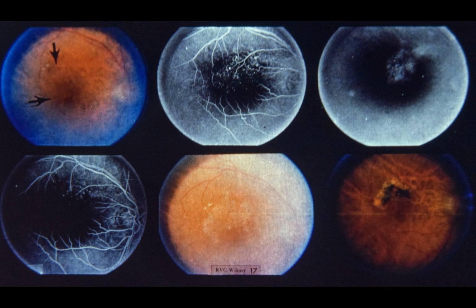As seen lower center, multiple 100 micron spot lesions at 0.1 seconds duration and 250 milliwatts power were delivered to all areas of paramacular leakage and to areas of retinal non-perfusion as seen on the fluorescein angiogram. Lower right, note photocoagulation scar superior to fovea 6 months after treatment. Visual acuity improved from 20/70 to 20/25 and has remained 20/25 for 1 year.